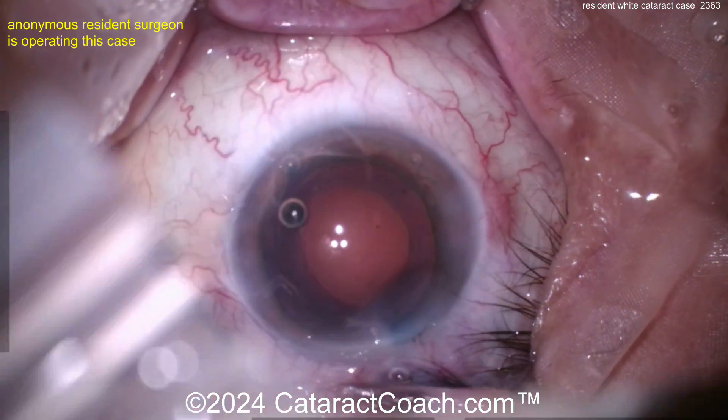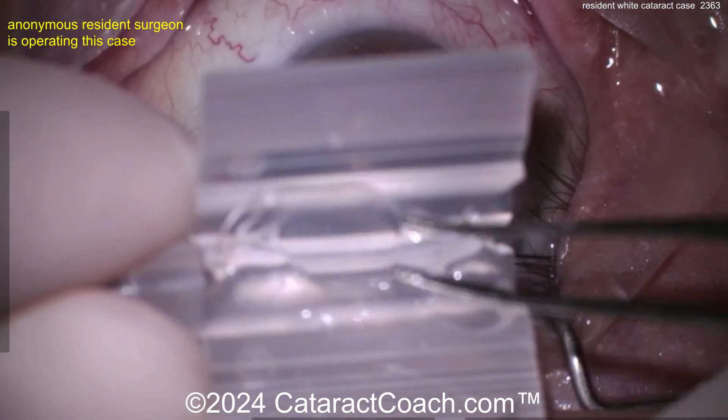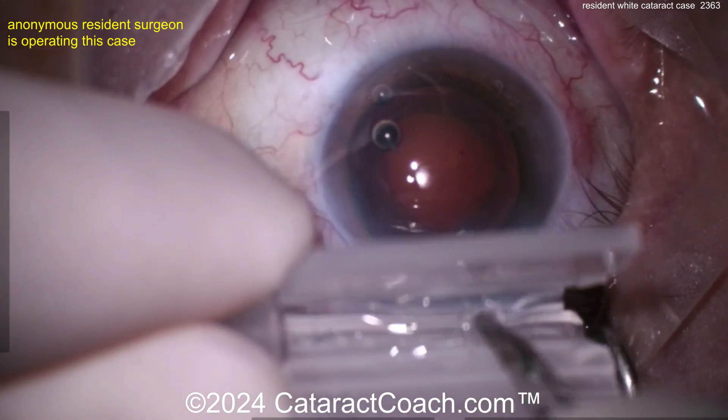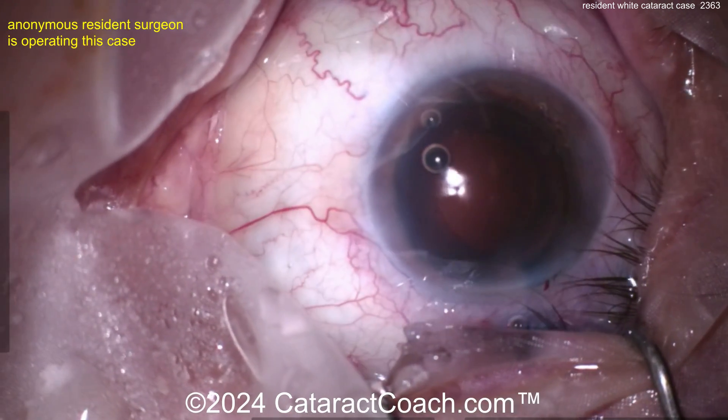Now let's see what we've got for a lens. I like seeing a young resident loading up their own lens — fantastic! Looks like a single-piece acrylic hydrophobic lens. Put that in the injector, close it up, add viscoelastic, and let's see it being delivered.